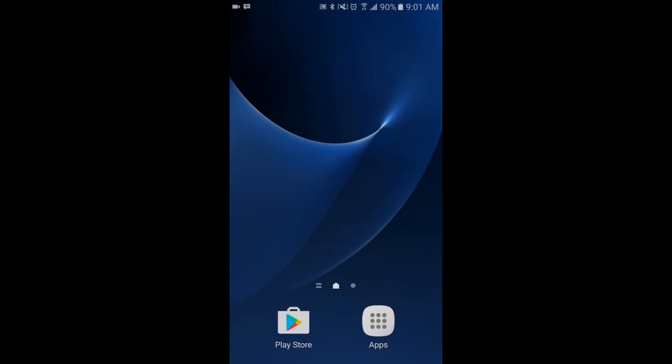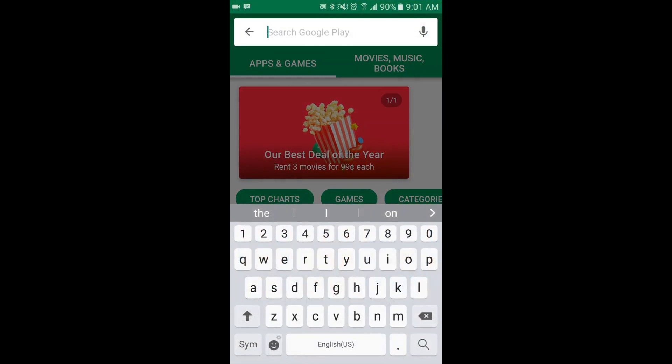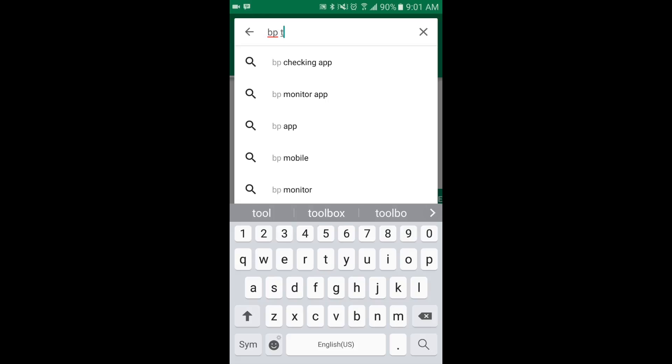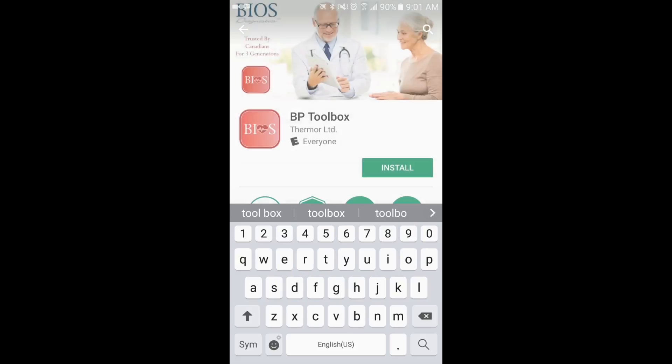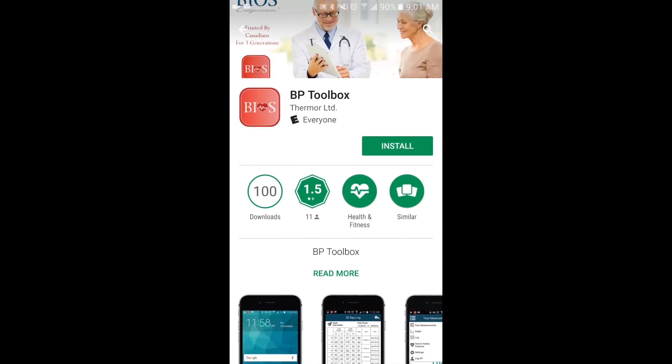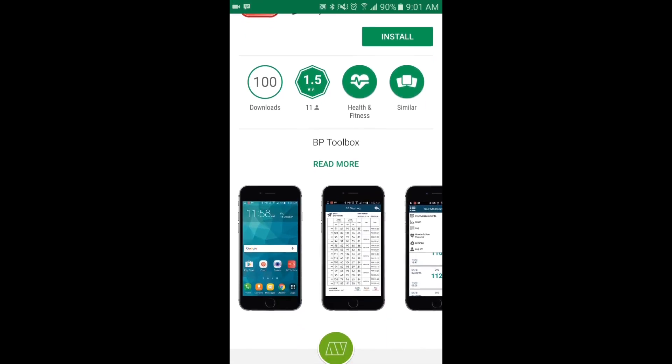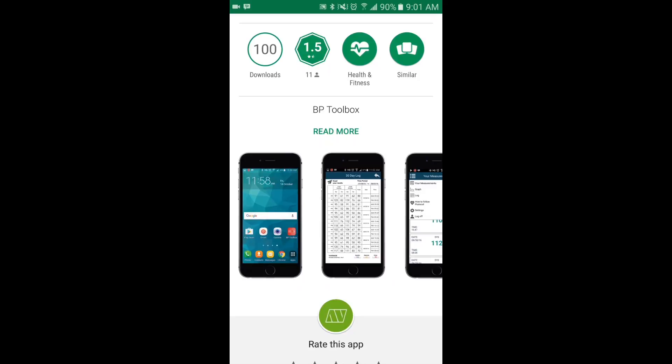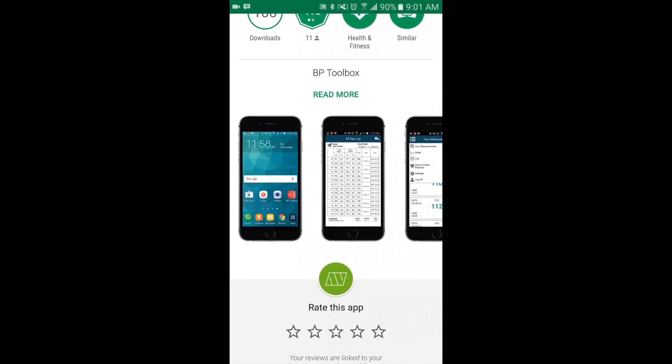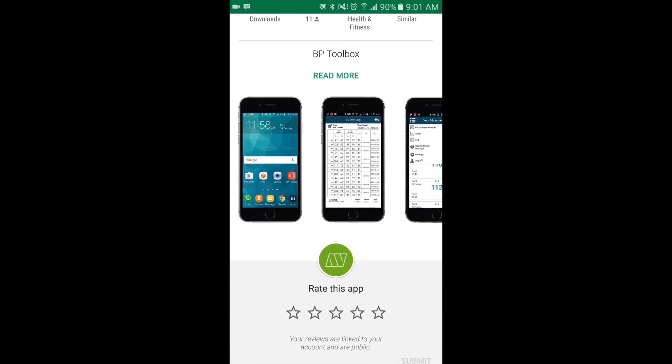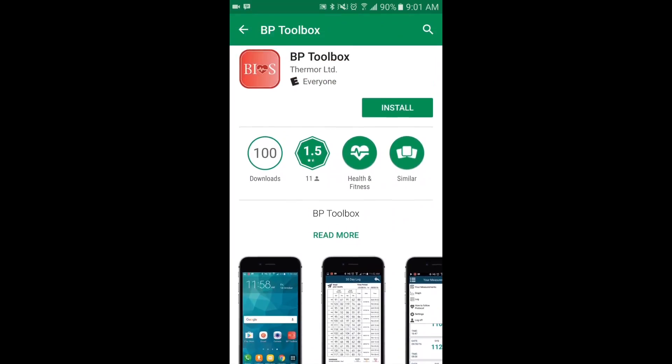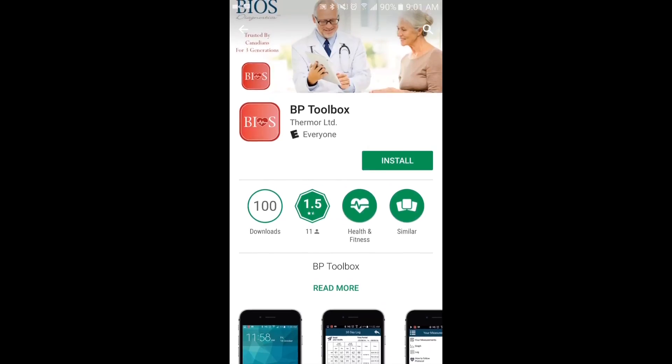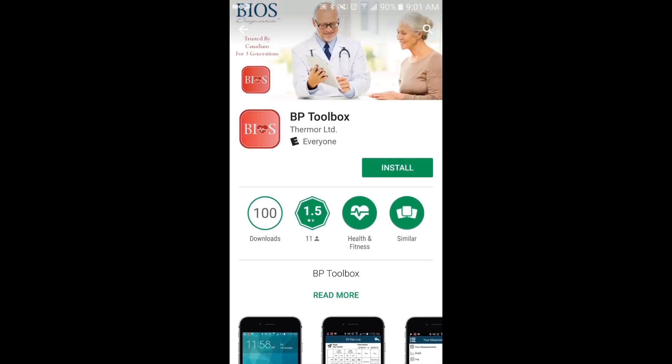Downloading the app to your device is simple. If you are downloading it to an Android device, first launch the Google Play Store app. While in the store's home screen, select the search bar and type in the app's name, BP Toolbox. Select the app and tap Install.